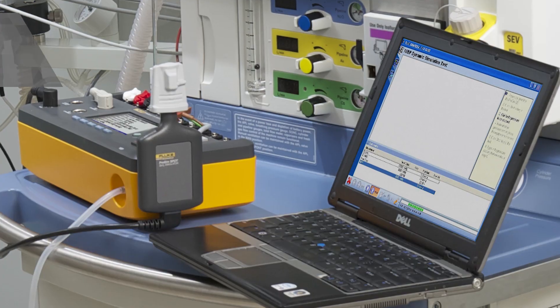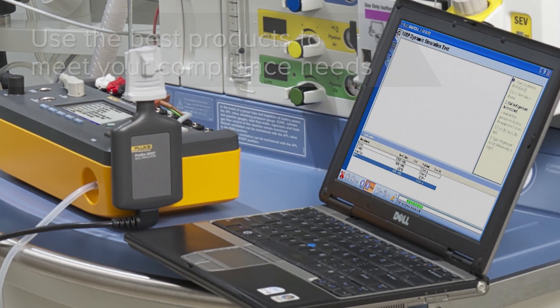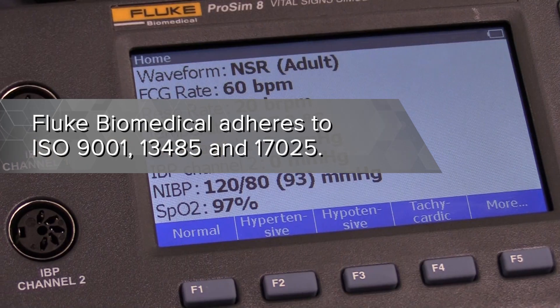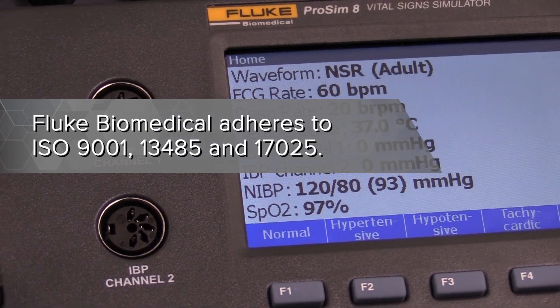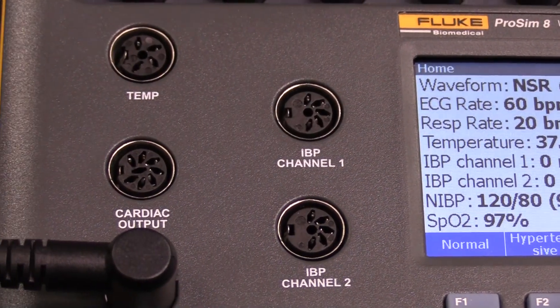Purchase Fluke software solution for regulatory reporting and procedure standardization. This also allows for the automation of your test procedure. Fluke Biomedical adheres to ISO 9001, 13485, and 17025 so you can rest assured knowing that you will consistently receive a quality product that will meet your expectations and regulatory requirements.